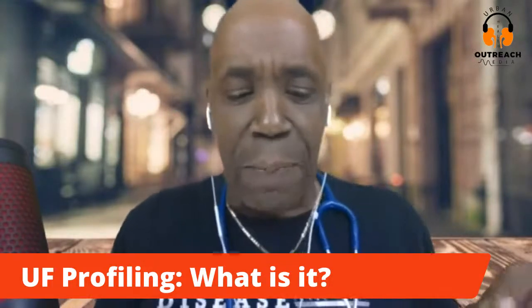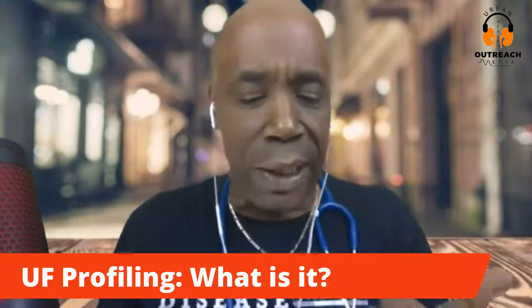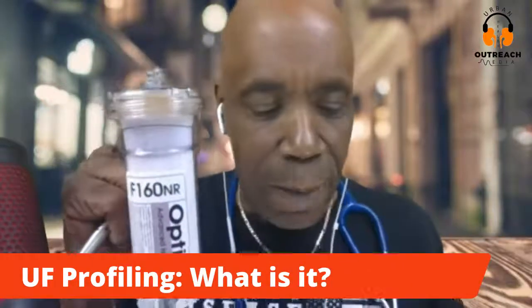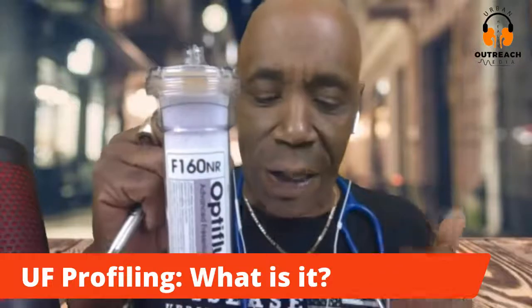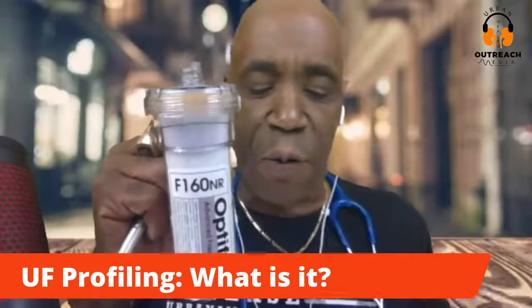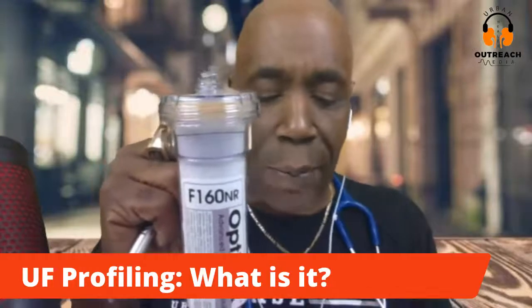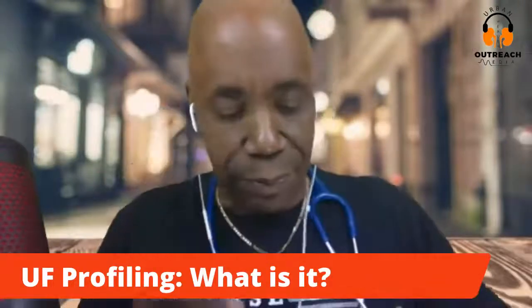As I said, this type of profile creates more fluid removal during the first part of the dialysis treatment when extra fluid is present in both the blood and in the tissues. Later in the run, after the dialyzer has removed much of the extra fluid, the rate of ultrafiltration is decreased. This decrease then allows more time for the remaining fluid to move from the tissue to the blood, to get caught up with the ultrafiltration occurring within the dialyzer.